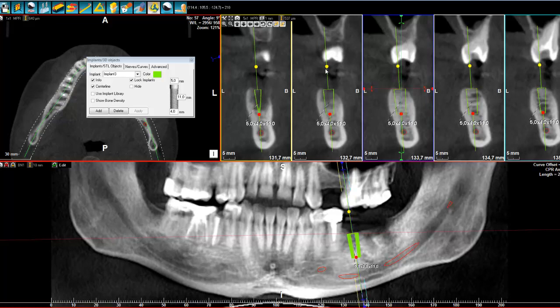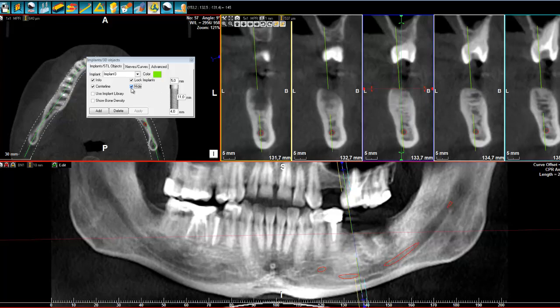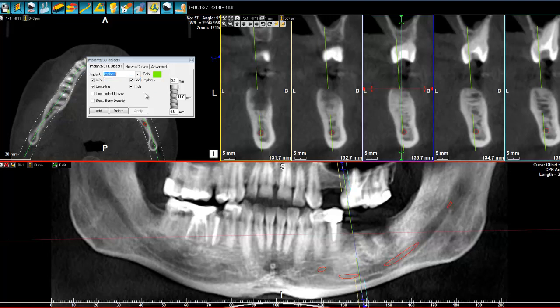You want to be sure you're actually modifying the settings on one implant and not the other. If you get too many implants in your view, you click on hide and you cannot see it anymore — you still see the center line but not the implant. That means you don't have any obtrusive elements when placing the next one. If you want to select it back again, you come here in this list. Of course, if you have more implants, you will get all the different names — and then you can simply unhide it.